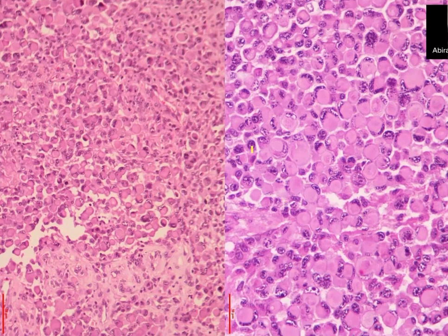Can you call these gemistocytic cells? They are more epithelial, rhabdoid. Gemistocytic will never be discohesive. And the matrix, you can see the clear spaces. There is no matrix flowing. They're discohesive. Gemistocytic will have processes, cannot be so rounded off cells. You should not use gemistocytic for this. This is typically what you call rhabdoid-like or epithelioid-like. Okay, but what is it?